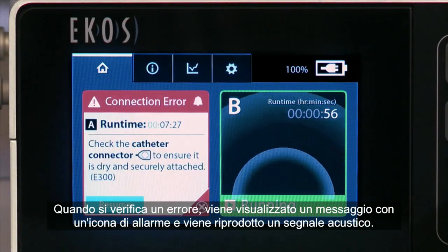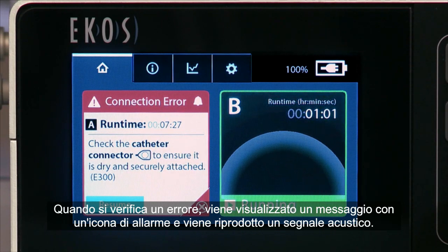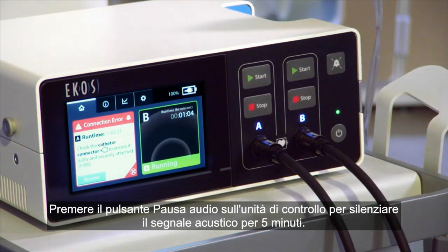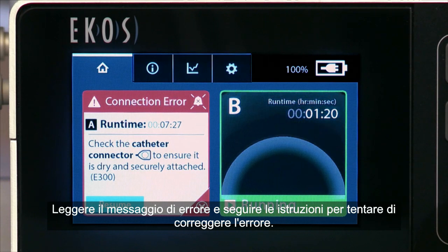When an error occurs, an error message with an alert icon displays and an audible tone sounds. Press the audio pause button on the control unit to silence the alert tone for 5 minutes. Read the error message and follow the instructions to attempt to correct the error.